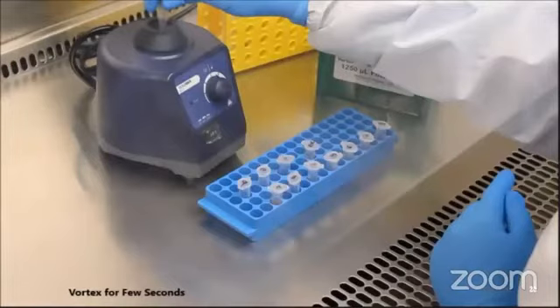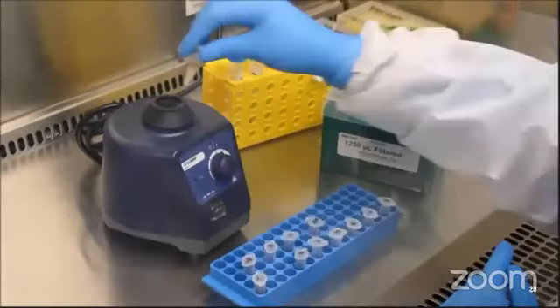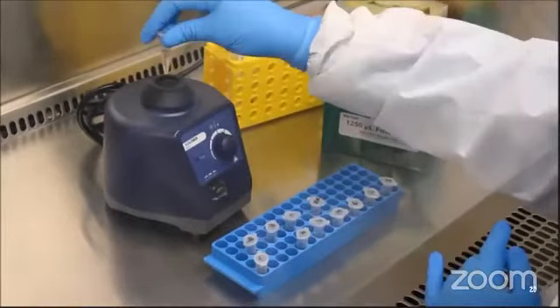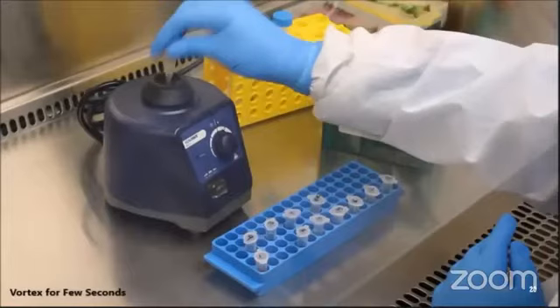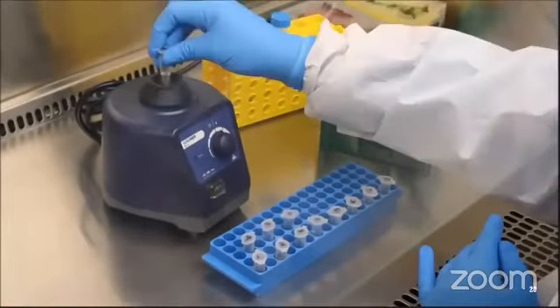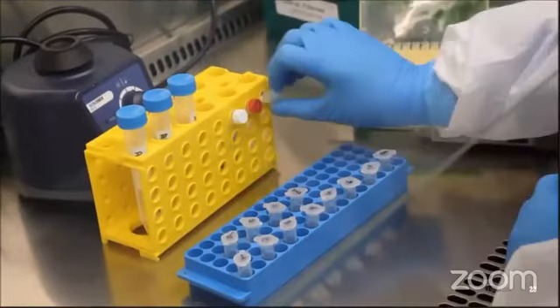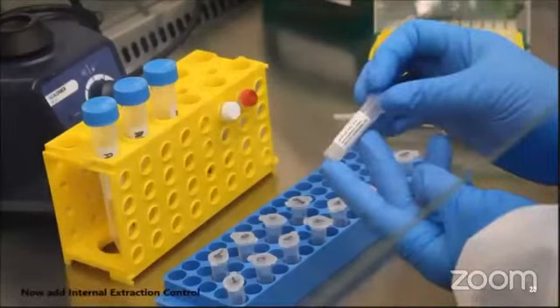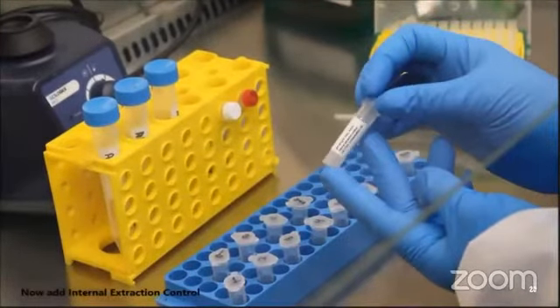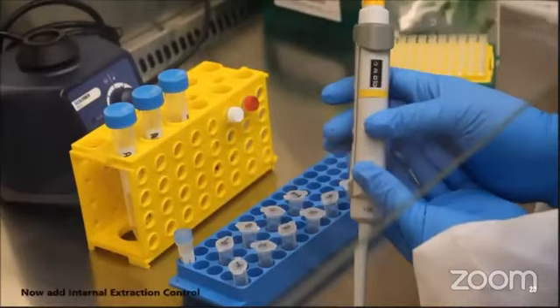Now, vortexing of the sample. This vortexing and pipetting produce aerosol of different characteristics and different potential. So the general rule of thumb is to carry out these aerosol-producing procedures within the biosafety cabinet. After the addition of negative controls and samples, now add 20 microliter of the internal extraction control.